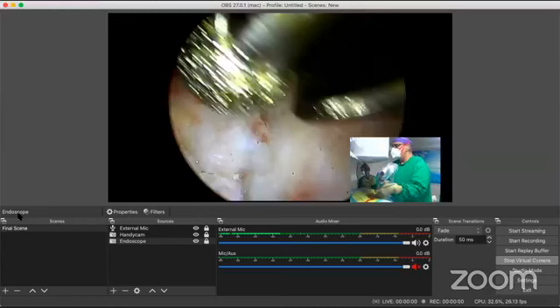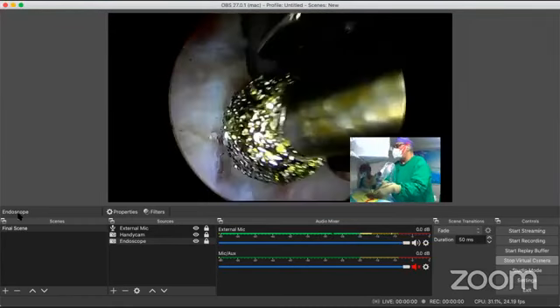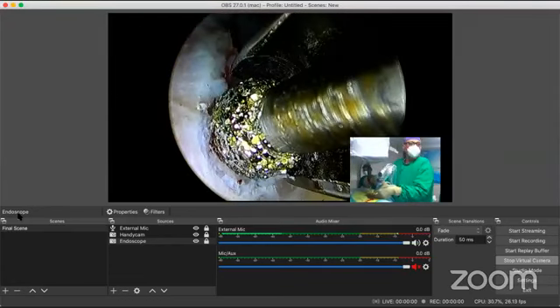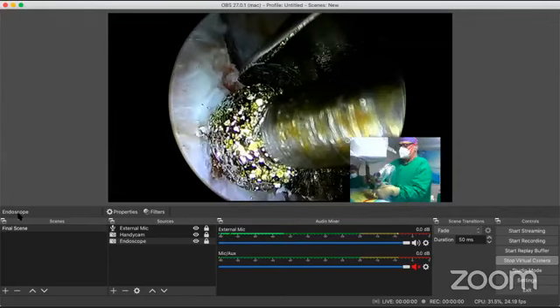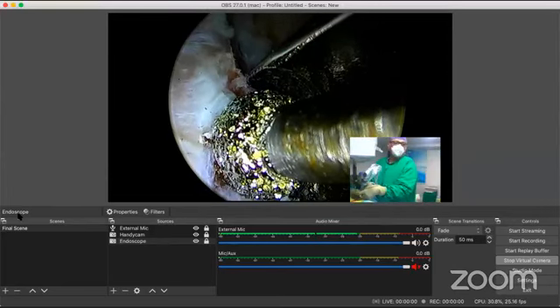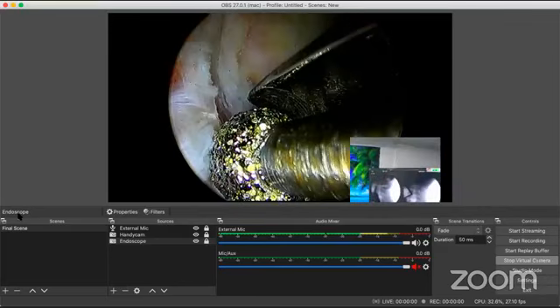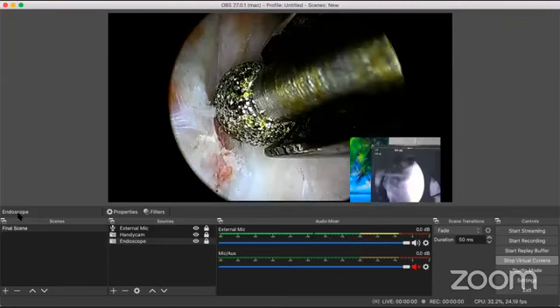Now, why we had marked our point of drilling, end point of drilling was here. Correct? Take a shoot, please. Shoot, please. Surely when I'm taking a shoot, where are you supposed to be showing? Now you realize how far I've come out. So I don't have to go here, I have to go till here. Shoot, please.